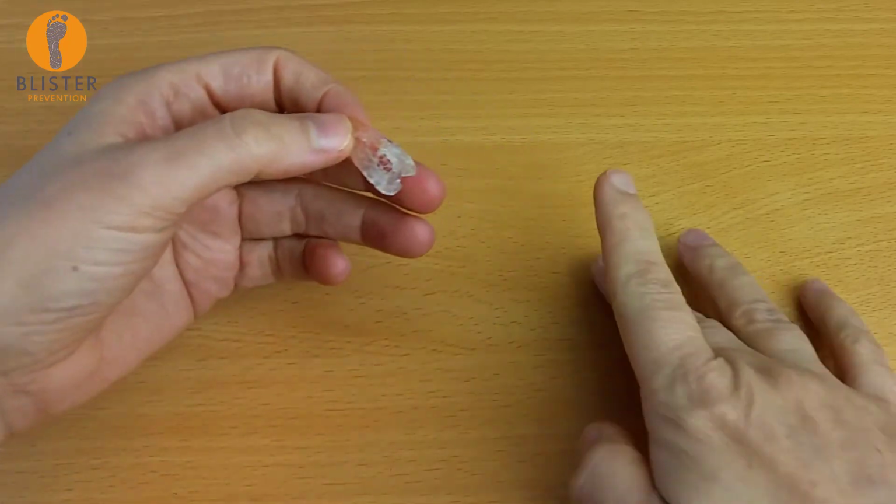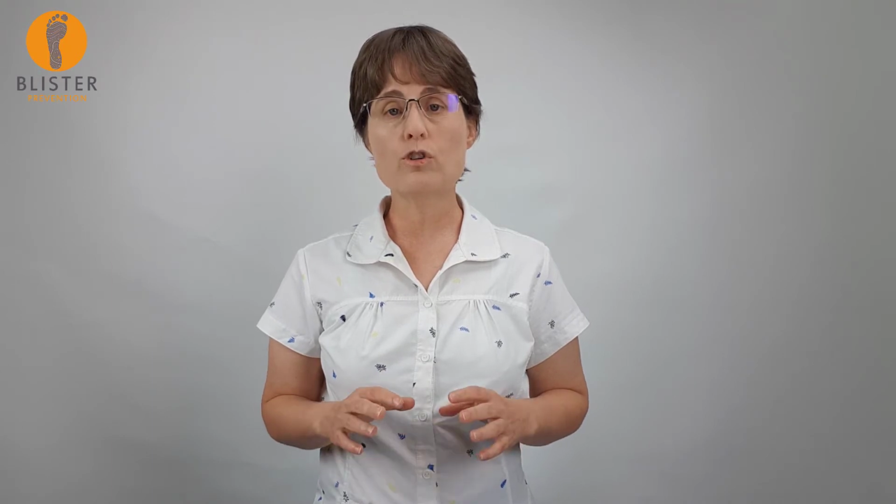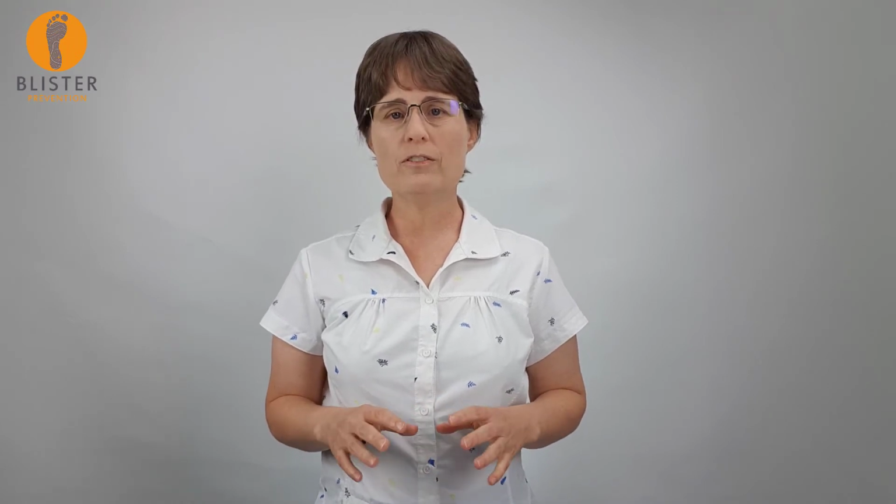However, on weight-bearing areas, it works too well initially, and then the hydrogel wears through too quickly to become ineffective. So I would say these are suited mostly to blisters on non-weight-bearing areas of the foot and areas of low pressure. And unfortunately, this very short-term effect takes them out of the equation for anyone involved in endurance activities, anyone looking for blister management that lasts all day.